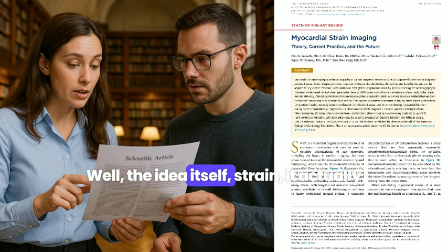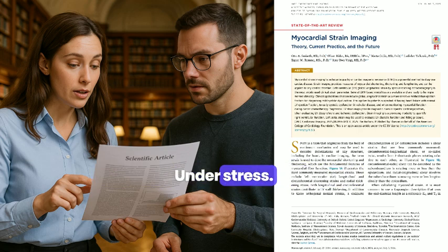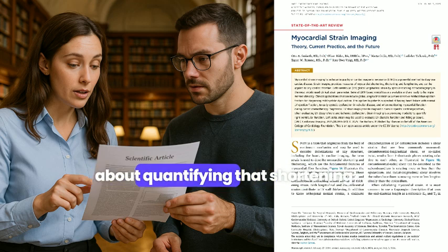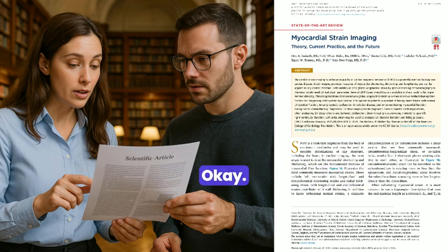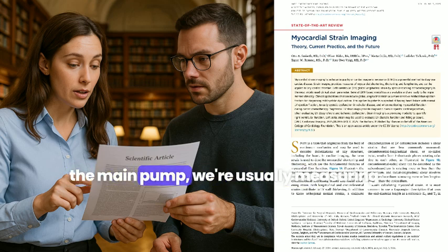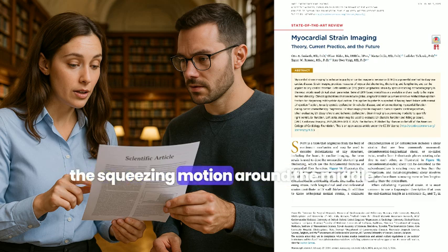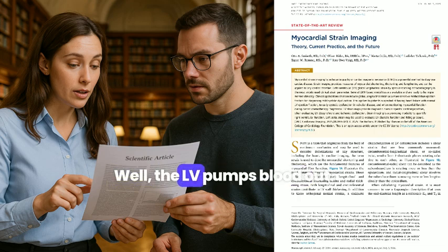Well, the idea itself, strain, actually comes from engineering, describing how materials deform. Great, under stress. Exactly. So for cardiac imaging, it's specifically about quantifying that shortening and thickening of the heart muscle, the actual mechanics of contraction. Okay. And for the left ventricle, the main pump, we're usually measuring longitudinal strain, that's the shortening along its length, on the long axis. Yep. Then circumferential shortening, sort of the squeezing motion, right in the middle. Right. And radial thickening, how much the wall thickens up. All three contribute to how well the LV pumps blood out.